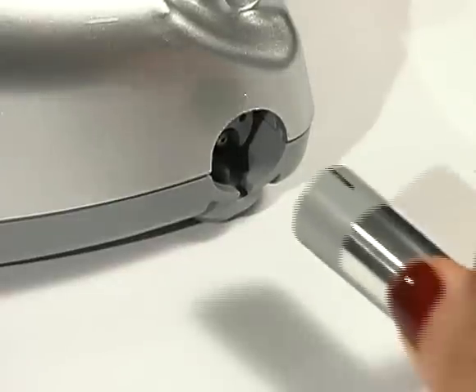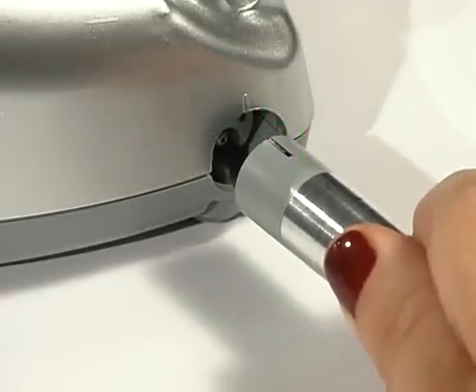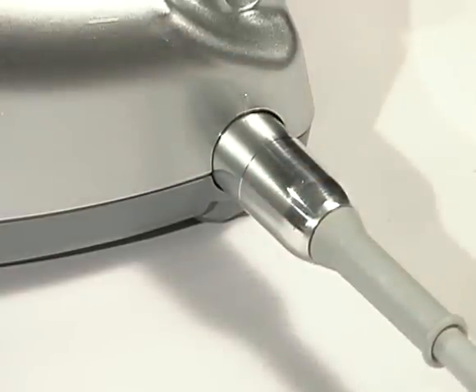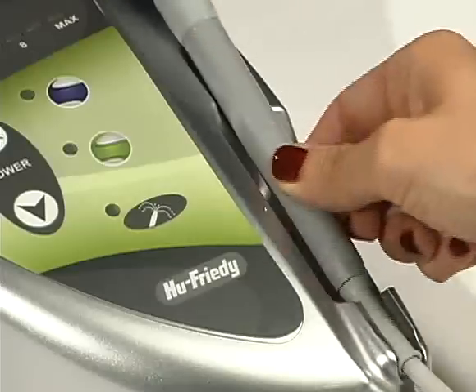Align the marks on the front of the control unit and the handpiece cord. Gently push the handpiece plug into the connector at the front of the control unit. Place the handpiece in the handpiece holder.